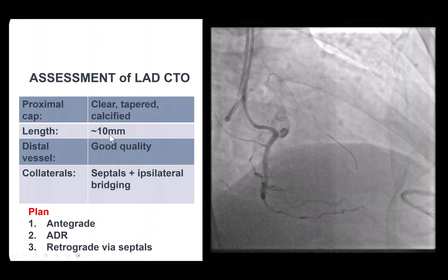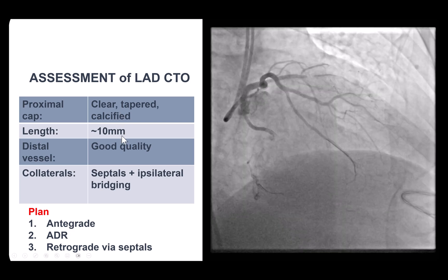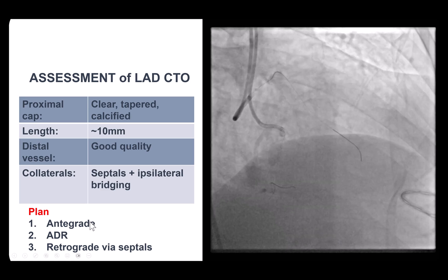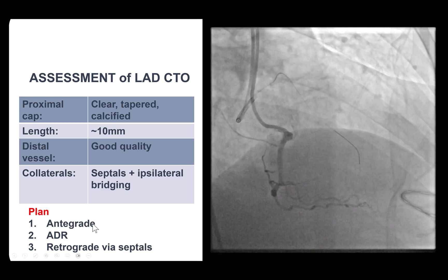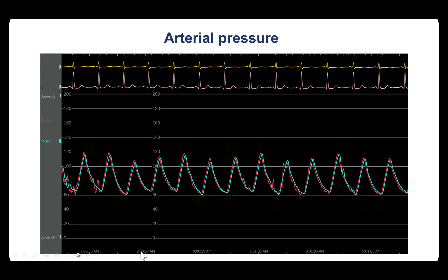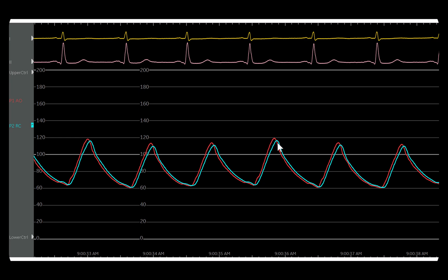Based on the short occlusion length, the clear proximal cap, and the good quality distal vessel, the decision was made to start with antegrade wiring as per the hybrid and global CTO algorithm. If that didn't work, use ADR, and if that didn't work, go retrograde through septals. Another thing to pay attention to is the dual blood pressure tracings — this will become very important as we discuss how the case unfolded. The waveform is very important about what is about to come.